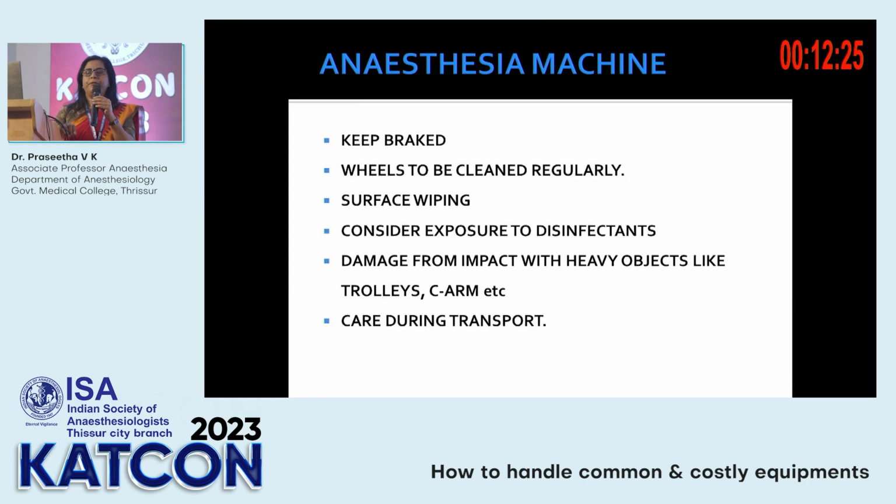After each case, you have to wipe the surface of the machine. In some OTs, nowadays we don't use fumigation for sterilization, but in olden days we used formalin, glutaraldehyde, etc. Whenever you are using fumigation, these machines have to be put outside the OT, because workstations are not supposed to be exposed to such disinfectants.